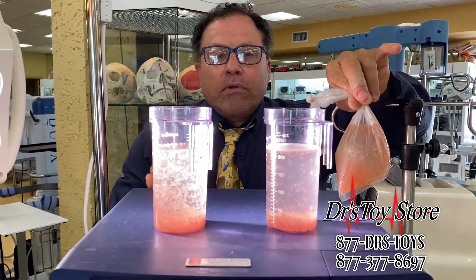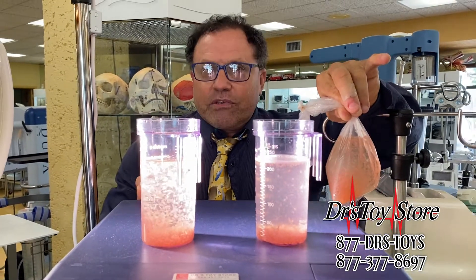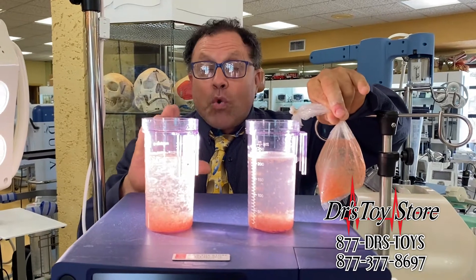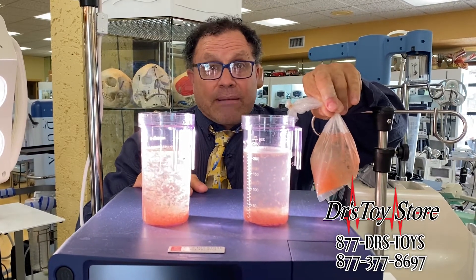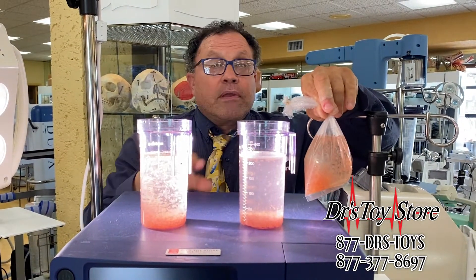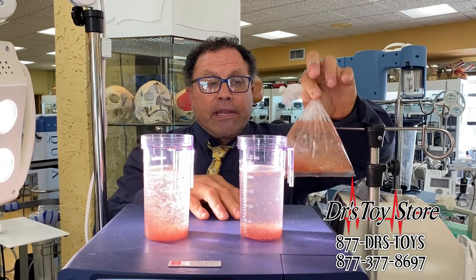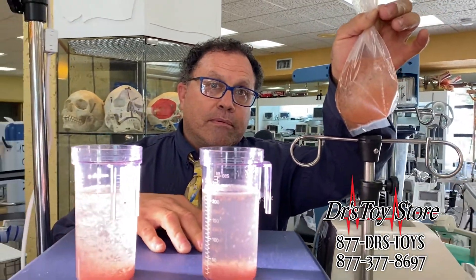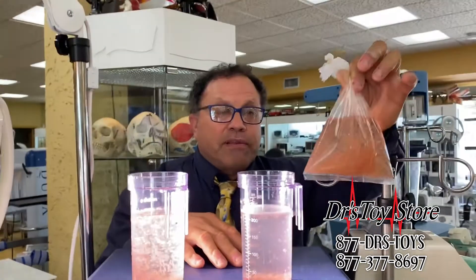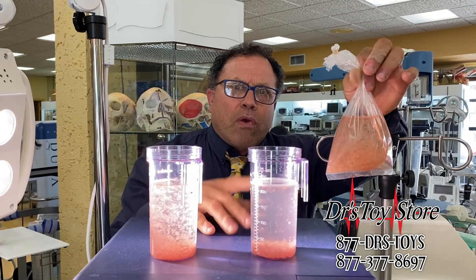Bottom line: you want viable stem cells. You don't need to use all that speed. If you're not going to use the fat, by all means turn it up and blast away. But as far as stem cells go, you better pick up a Pure Sculpt because you're not going to have the results you want. Call the Doctor's Toy Store today — 877 DRS TOYS. And let's have a big hand for the brine shrimp. They did a good job, even though some of them gave up their lives. Reporting for the Doctor's Toy Store — Rob Raymond.